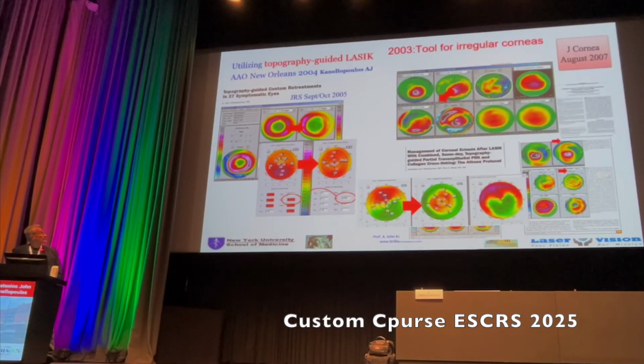And this was the first attempt back then to treat keratoconus. And at that time, even Theo Seiler said, that's unethical. You should never do laser in keratoconus. And now we know this is mainstream. Even at the IROC Center in Zurich, many people do perform surface ablation combined with CXL, what we call the Athens protocol. It's something that's practiced internationally under different names, but we're very happy that many people have moved on to the approach of using a very frugal, as far as tissue removal, customized treatment along with CXL, and I'll explain why.